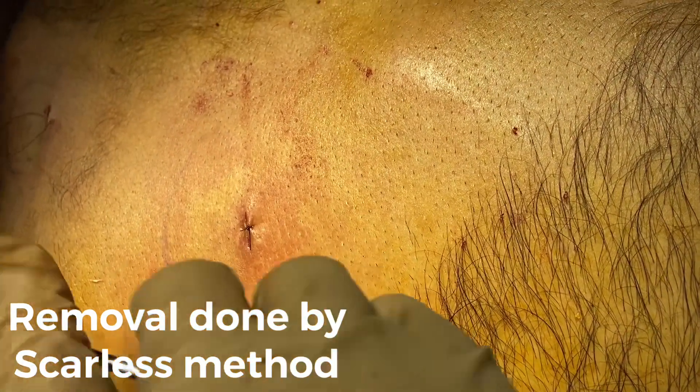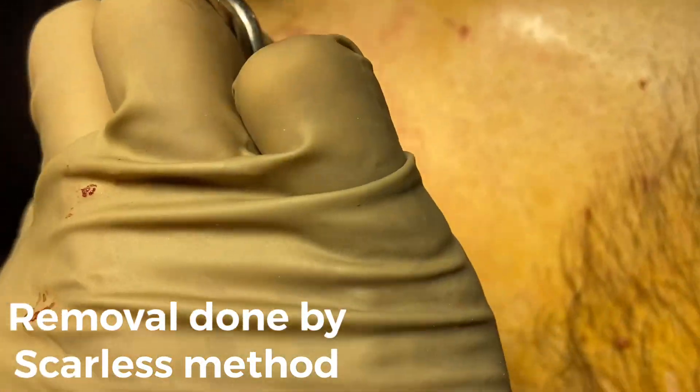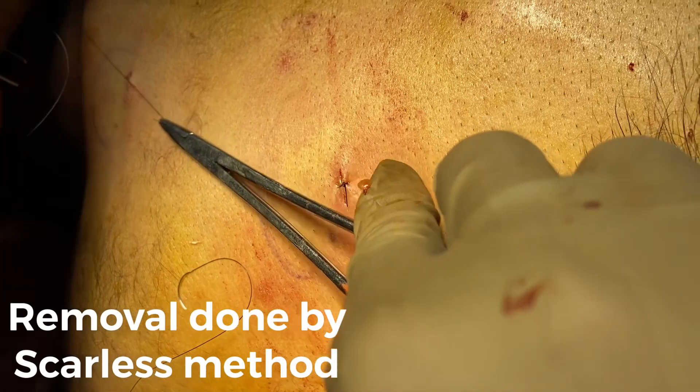This is a lipoma we have removed with this stab incision. Now we are doing suturing. This is a big lipoma — one, two, three incisions.